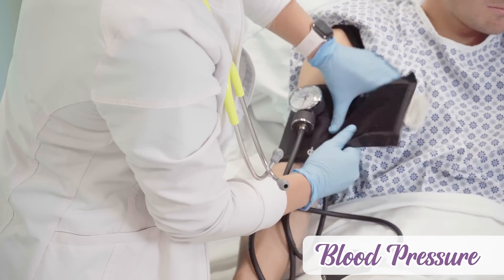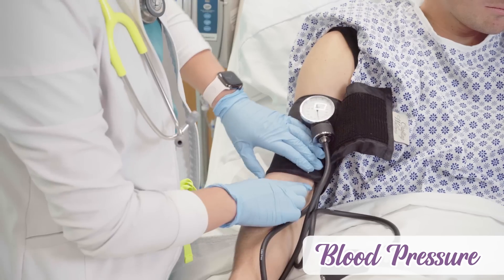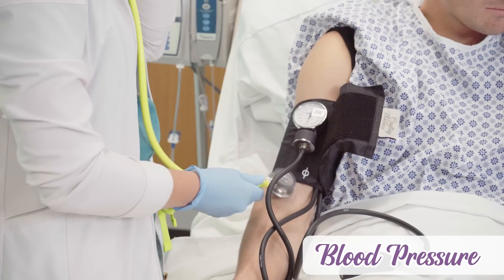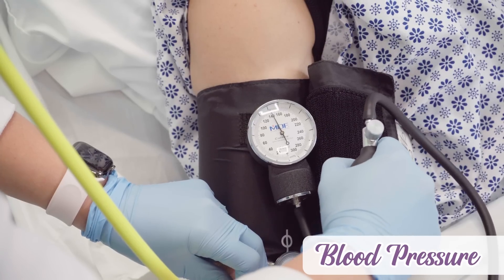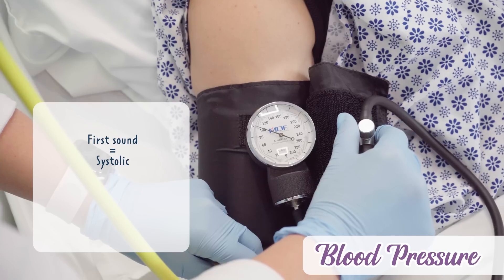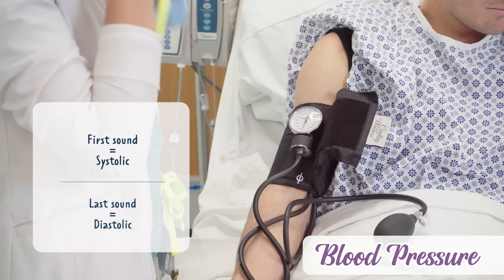Snugly place the blood pressure cuff on the upper arm directly on the skin — you don't want to place it over clothing. Two fingers should fit under the cuff, but it will be very snug. Locate the brachial artery and line up the brachial artery with the index marker on the cuff. Be sure the meter gauge is in full view on the side of the cuff. Then place the diaphragm of the stethoscope over the brachial artery. Inflate the cuff 30 mmHg above the patient's normal systolic. Then slowly deflate the cuff and listen for a sound almost like a loud pulse. The first sound you hear is the systolic pressure, and the last clear sound you hear is the diastolic pressure. After you hear the last sound, completely deflate the cuff and remove it from the patient's arm.